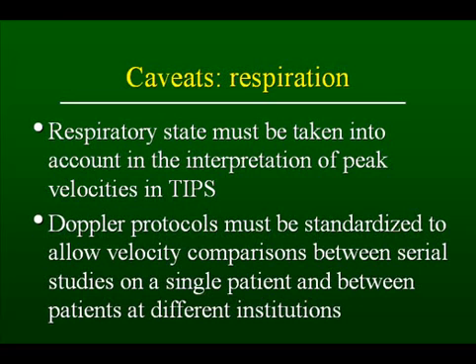And by that, I mean that you should standardize your Doppler protocols so that you do it the same way each time, or that some notation is made in the report so that the person doing subsequent studies will do it in the same way.